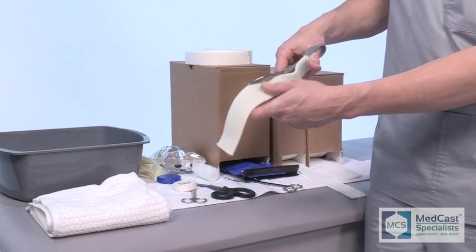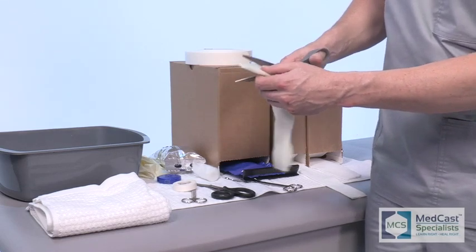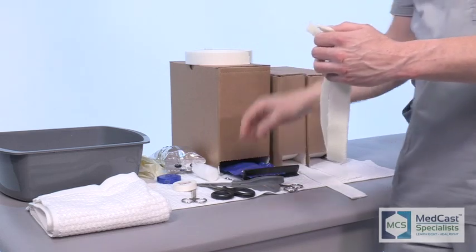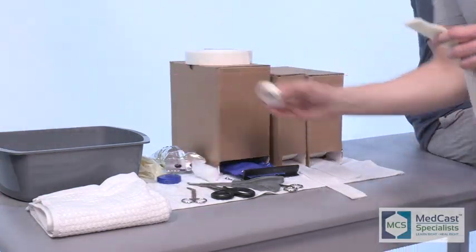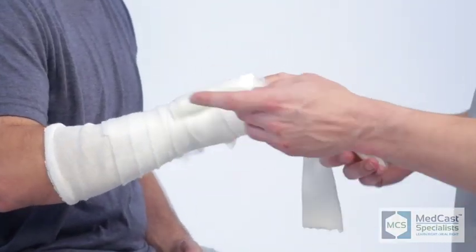There are a lot of techniques you can use here. You can get one-inch splint material and put a strip on the dorsal and volar side. Take a two-inch piece of splint material and cut about a half inch — for a pediatric patient, a one-inch piece would work perfectly. The idea is just to reinforce the strength so you're not having to use a lot of cast material to make it bulky.